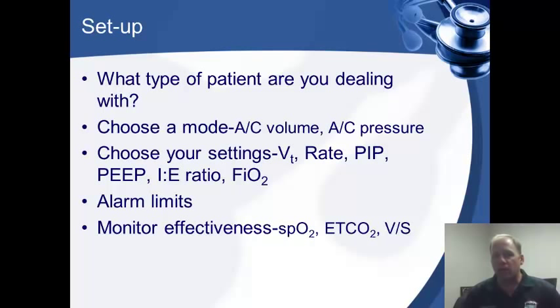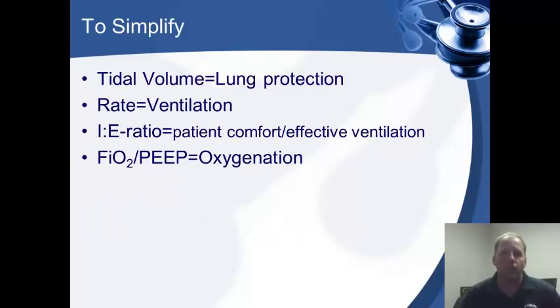Once we get those settings input into the vent and the patient's going along and ventilating, we want to monitor its effectiveness by looking at our CO2, looking at our pulse ox, and watching our vital signs, and keeping an eye on our heart rate and blood pressure. Blood pressure can drop with increased PEEPs, and our end tidal can change with too high of a rate, too low of a rate. So we're going to want to watch those things.